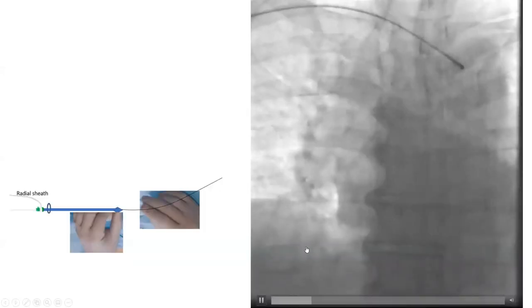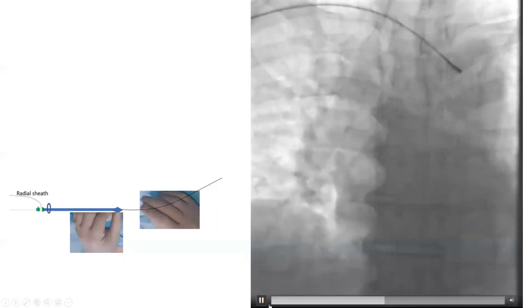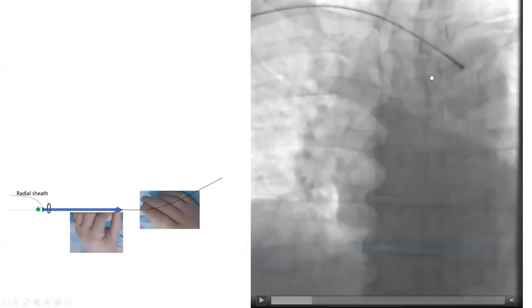A lot of those may seem simple, but it's about simple techniques sometimes. The catheter and the wire went into the descending aorta. So the question is how to get back into the ascending aorta. You can see the wire is in the descending aorta — how to get back into the ascending aorta?